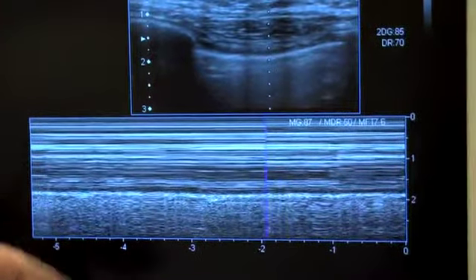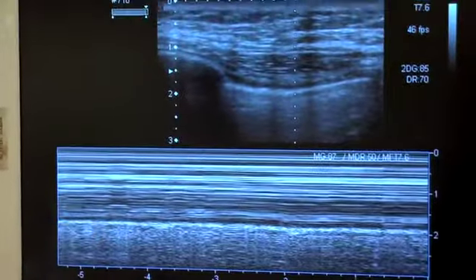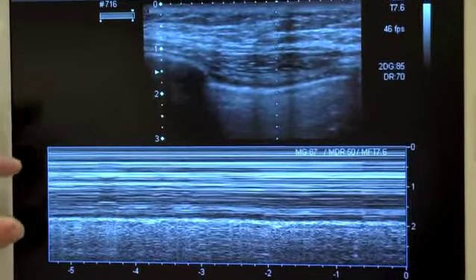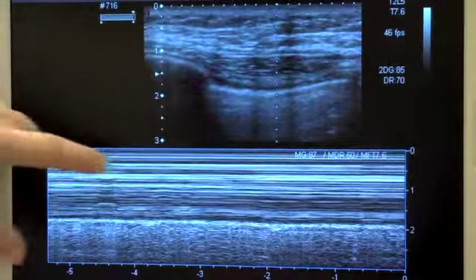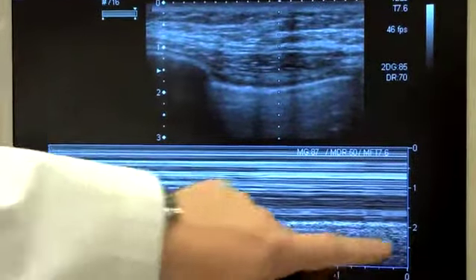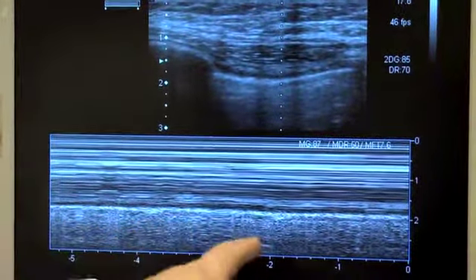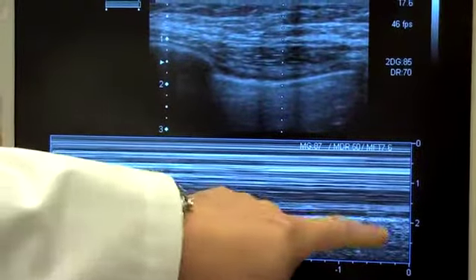What we're looking for to rule out pneumothorax is what's called sky, ocean, beach. Basically, this is the sky. This is the ocean. You see how it's a little bit different echogenicity, and this is the beach. You can see how it looks like a sandy beach. This beach is demonstrating kind of shaggy motion along this brightly echogenic pleural line right here. If there's motion along that pleural line, that means there's no air in between those two interfaces and therefore excludes the pneumothorax.